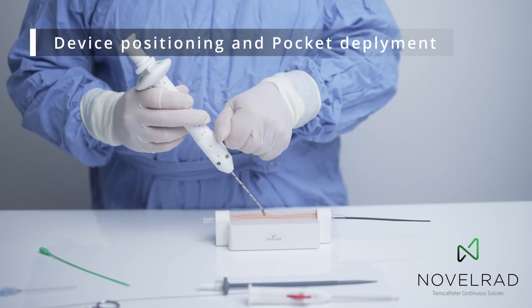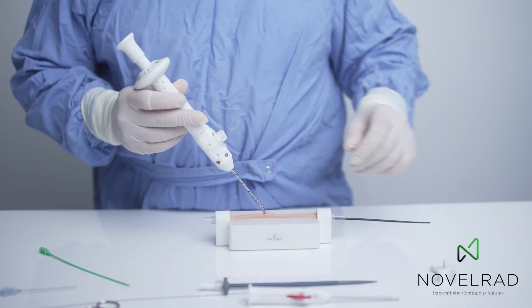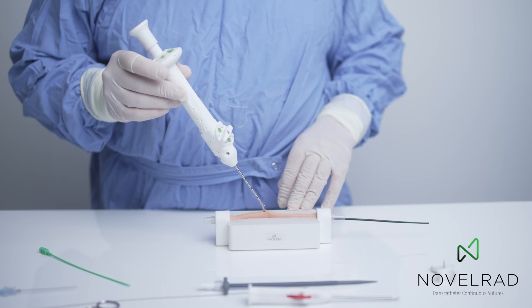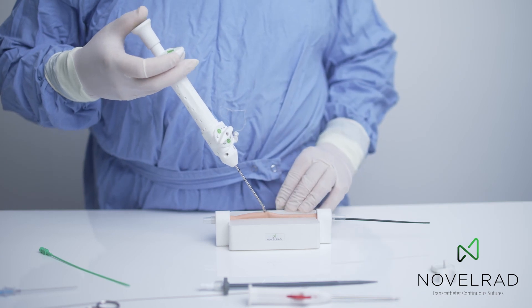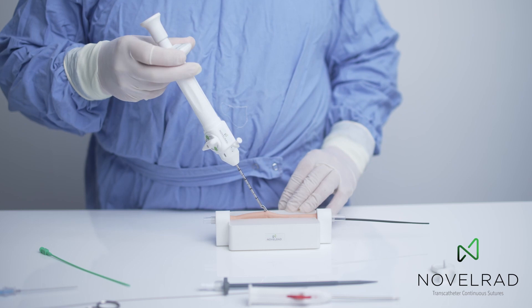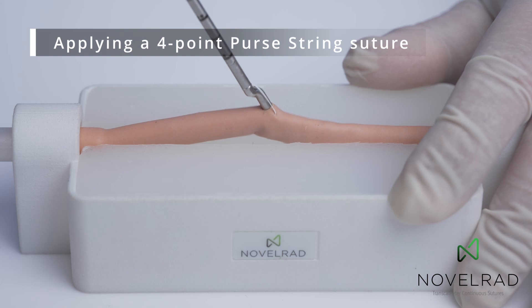The pocket is then opened, and the safety clip removed, so that the suture can be delivered. With just a mild traction, there is a pattern on the handle, and just by following the pattern and clicking with your finger, the suture goes in and is picked up, moved to the next position.